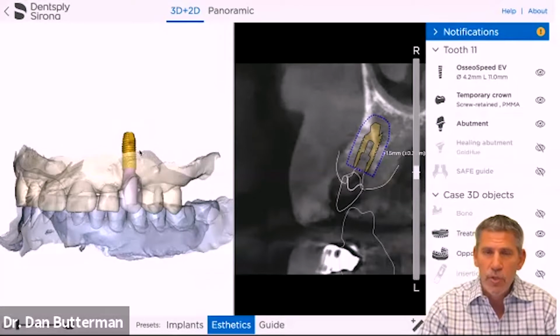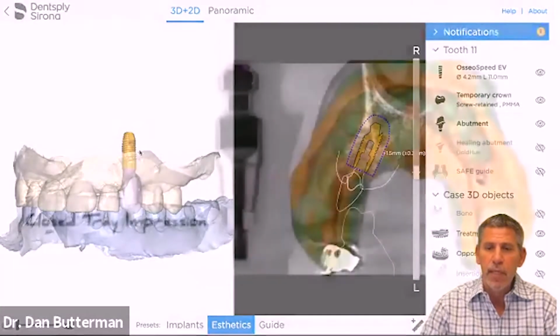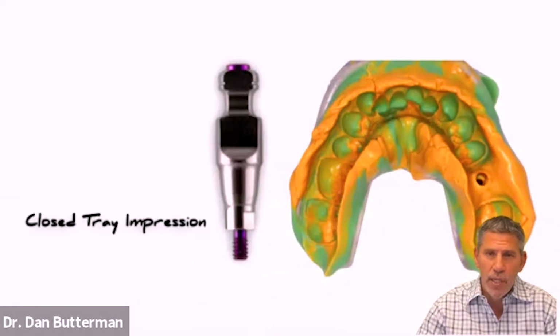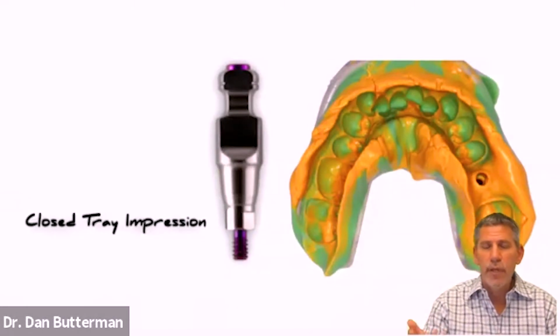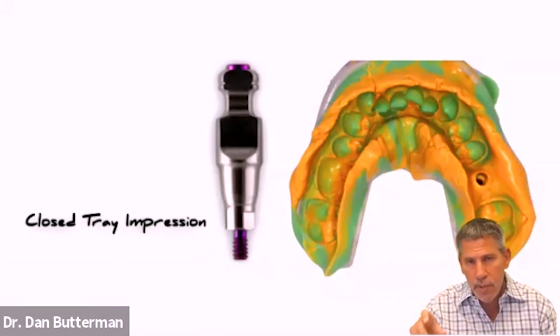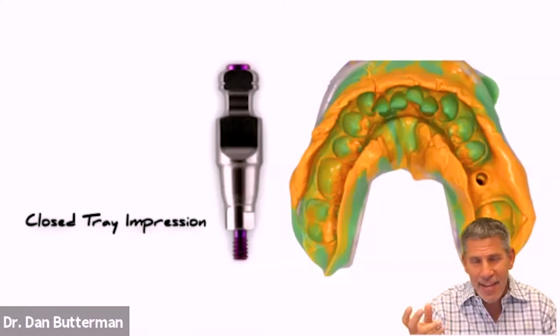Just with digital imaging alone, it opens the door to so many other possibilities in the workflows that are out there when it relates to implants. And then impressions. We've all done a standard closed tray impression, and maybe it's just a Denver thing, but every once in a while, I used to take that impression coping and I would seat it back into the impression, and the damn thing would have like a little bit of play to it.